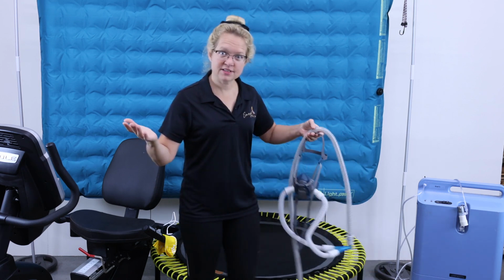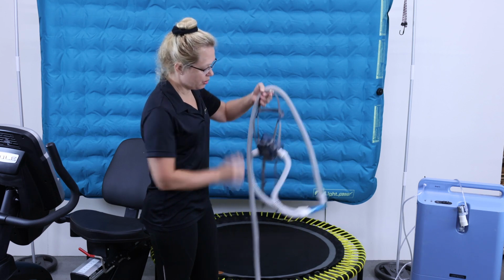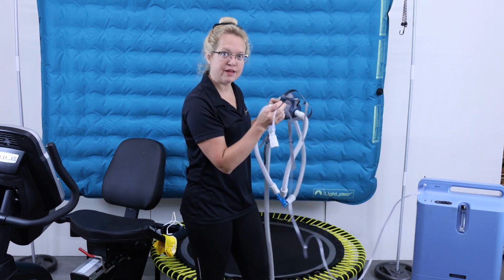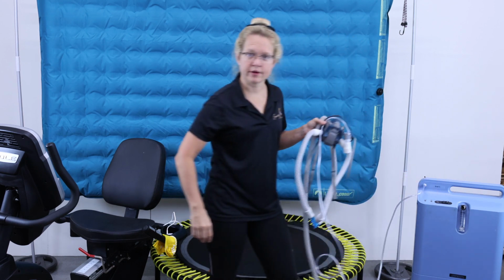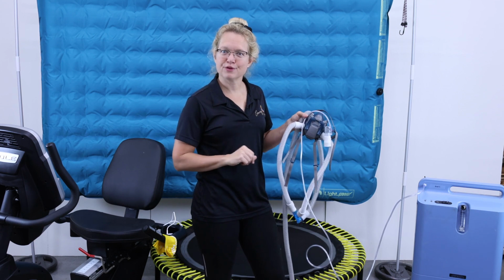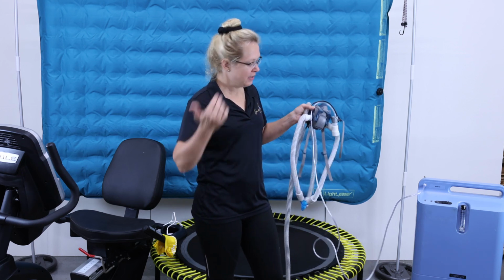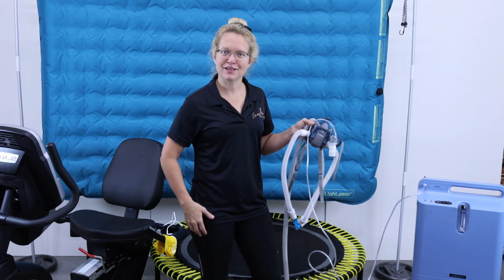So setting up your EWOT system, this one cost about $100. That was the mattress, the hoses, the mask, this little Y right here, and this hose right here as well, right? So all of that cost about $100, plus the cost of whatever concentrator you get, which can range anywhere from $300 for a refurbished one all the way up to $900. So you can spend a lot of money or a little. My system, the whole thing, was very inexpensive, setting it up the way you see here. All right, thank you very much.